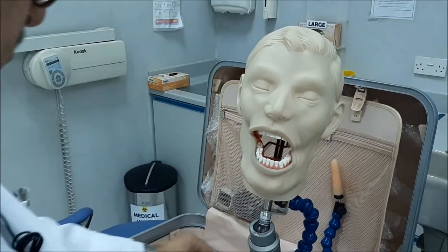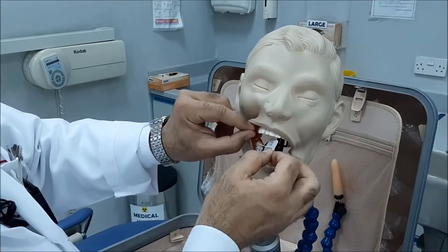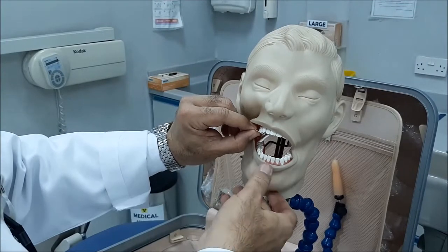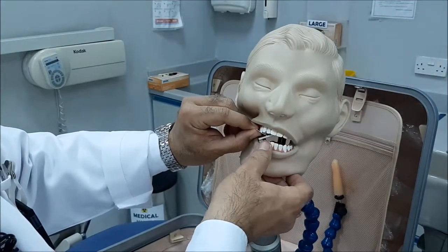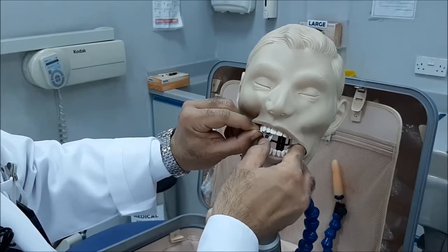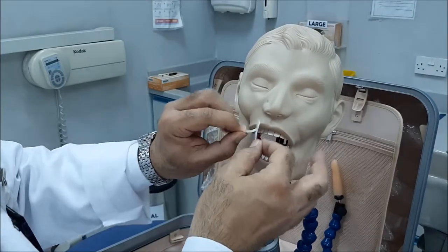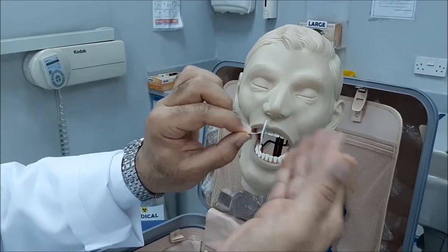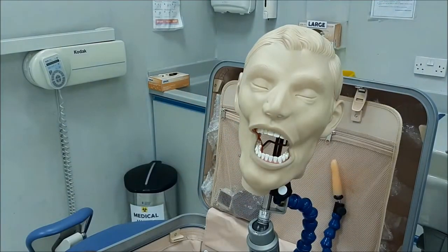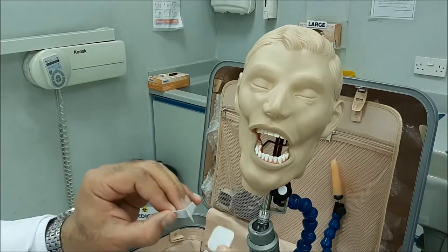Sometimes what can go wrong — I always see this problem — is that we bring the bite-wing tab too close to the buccal surface. What happens is that the patient bites on the film, and when we try to take it out, the film will be pushed by the lingual tissues and will detach from the holder, then fall down in the patient's oral cavity.